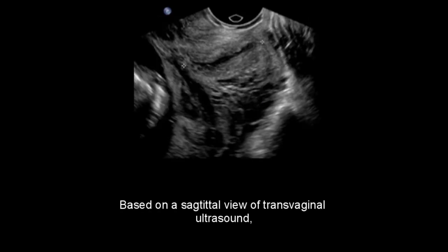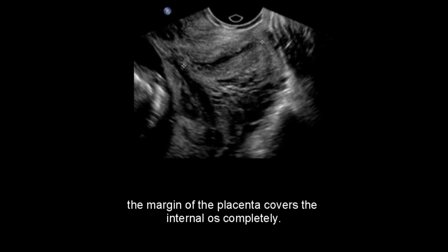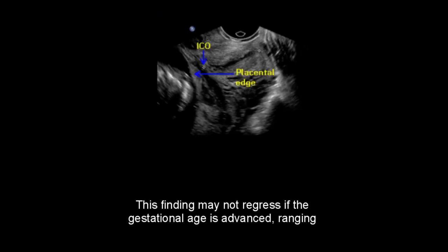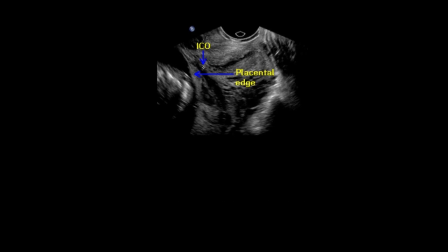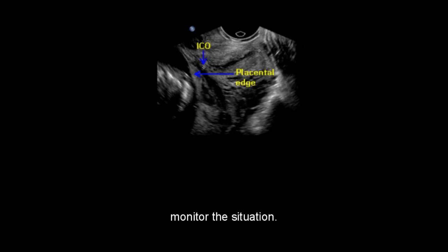Based on a sagittal view of transvaginal ultrasound, the margin of the placenta covers the internal os completely. This finding may not regress if the gestational age is advanced, ranging from 28 to 30 weeks; however, if the gestational age is earlier, regression is possible. It is recommended to have a follow-up clinical or transvaginal ultrasound to monitor the situation.